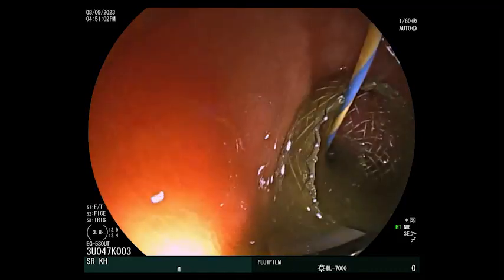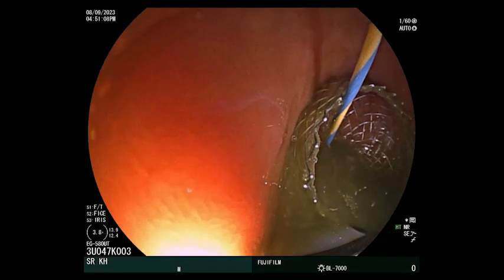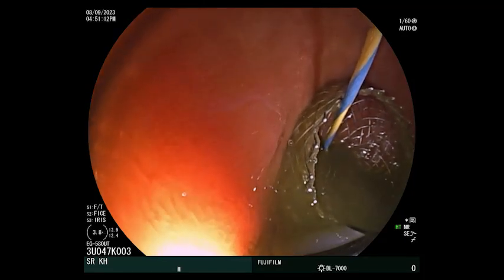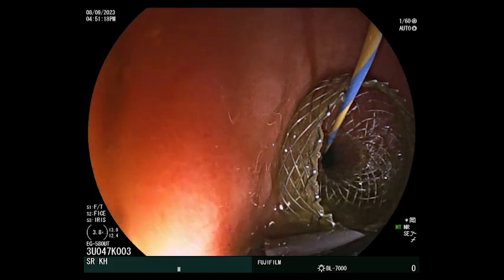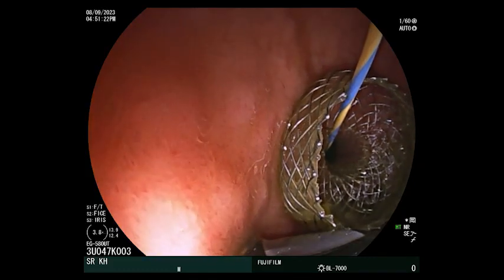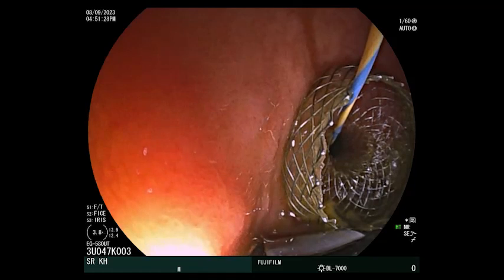So this is not well demonstrated. You know that for choledochoduodenostomy, we have a randomized study going on in Spain, which is called the BAMPI study. This is probable, but not sure, okay? But as this man is a 94-year-old man, I don't want to take any risk, and so I prefer to try to do that. Okay?